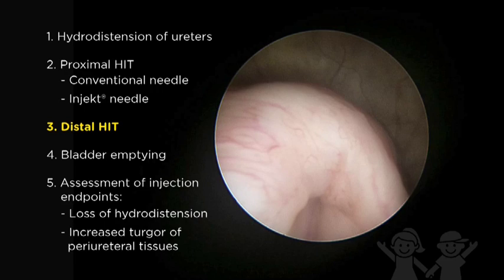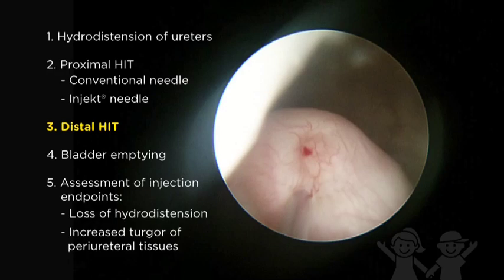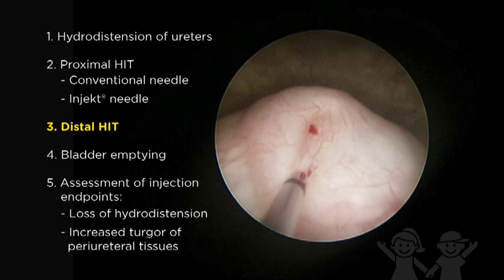Following the proximal hit, a second injection at the distal-most aspect of the intraureteral tunnel results in coaptation of the orifice. In this case, an identical procedure was performed on the left ureter due to abnormal ureteral hydrodistension.